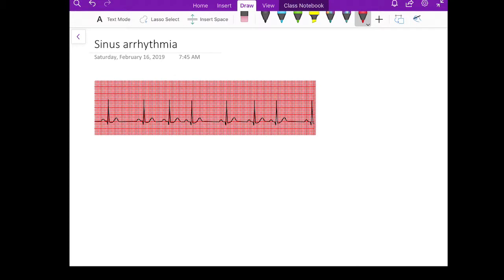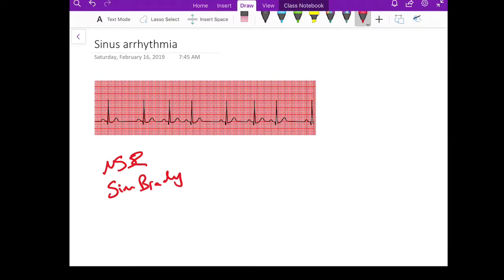Today we will talk about sinus arrhythmia. You will see this usually in the setting of normal sinus rhythm or sinus bradycardia. Sinus arrhythmia means that there's a variation between the P2P interval of more than 10%.